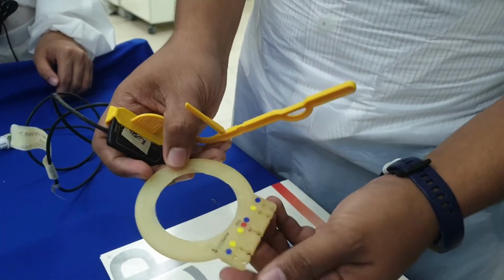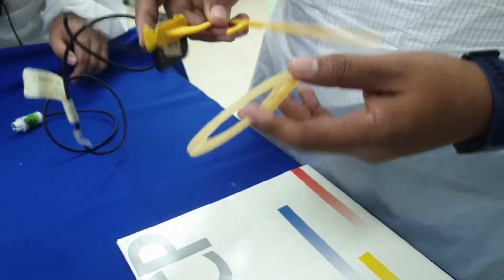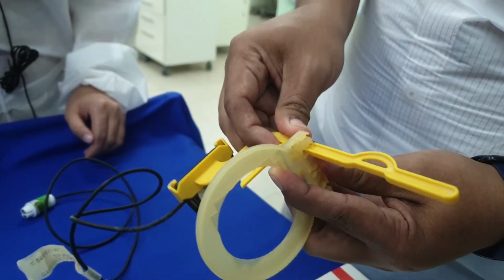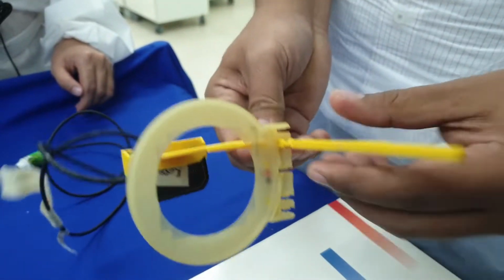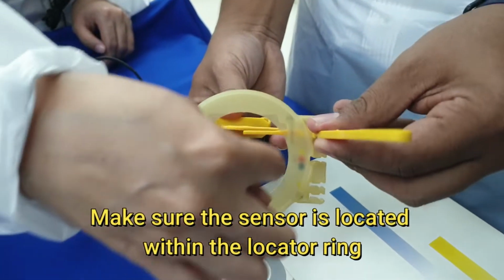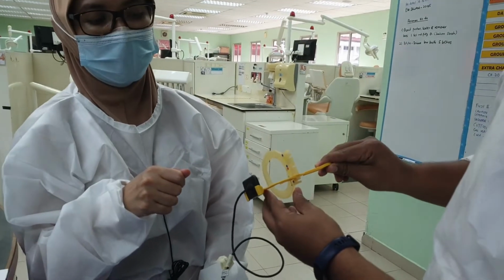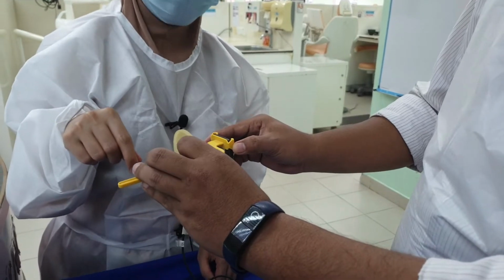Okay, then get the locator ring, again observe the color coding. This is periapical, yellow color, so place the holder, slot in the locator ring. Right. Ensure the sensor is within the diameter so that you won't get cone cutting. Right, this is for upper left tooth and lower right tooth.